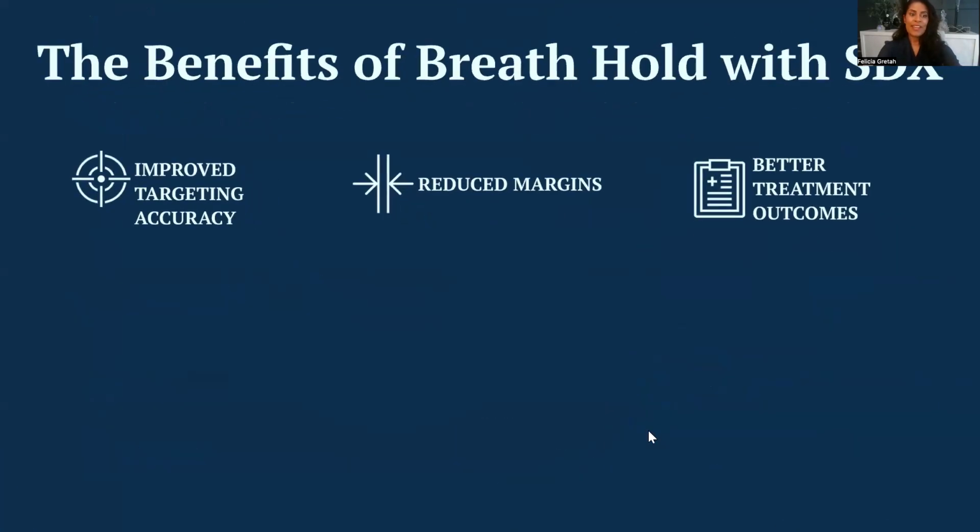Like we mentioned, precision is key. A breath can be the difference between hitting our target and risking healthy tissue. With a respiratory motion management system like SDX, we can take control of that breath and use that moment of stillness to deliver really accurate treatment. Also, since the target isn't moving, our physicians can draw tight margins, sparing healthy tissues and resulting in a better clinical outcome for the patients.